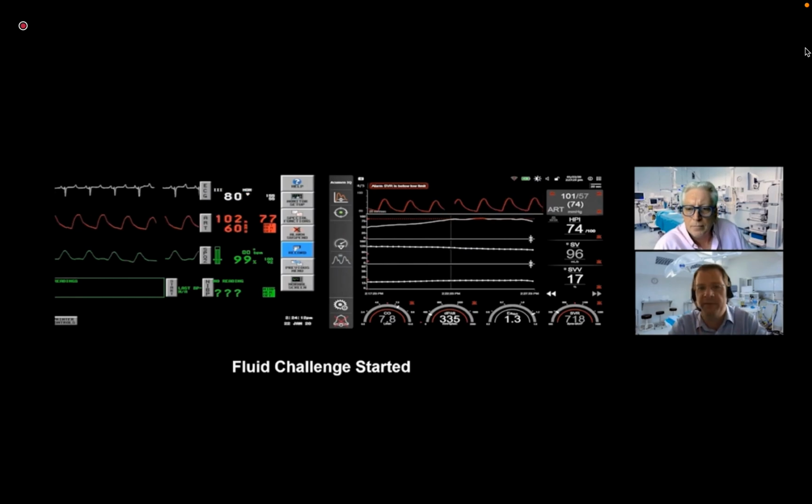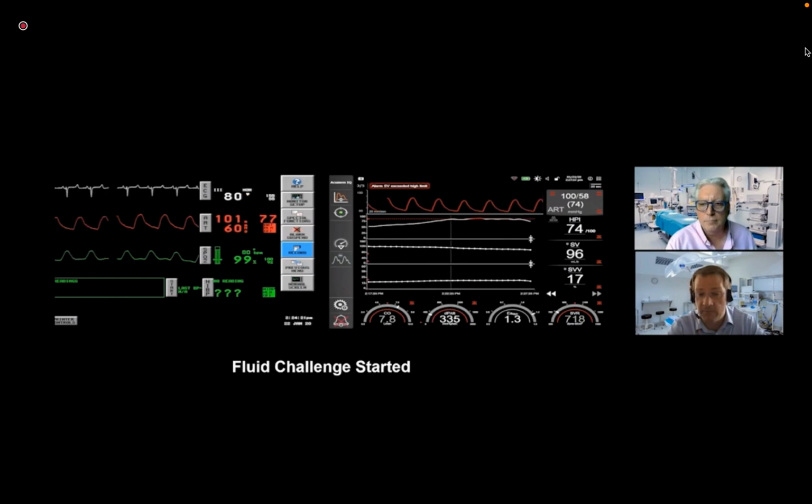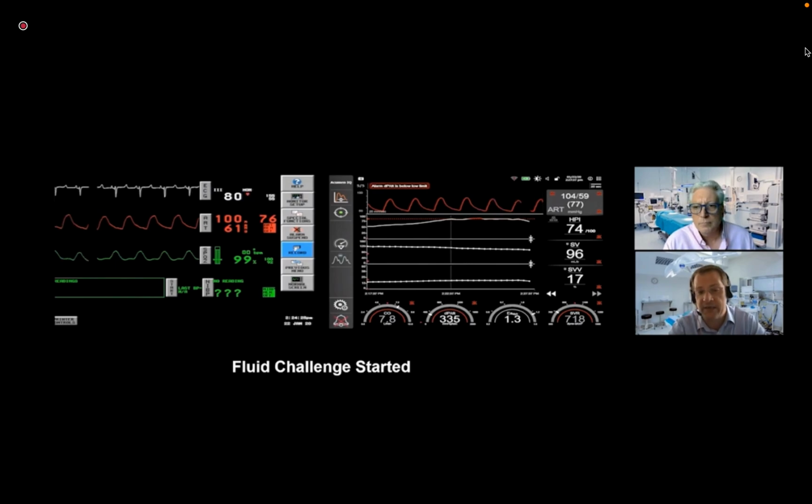So in this situation, we all know they need fluid. It's screaming high. SVV is really high. We know there's been a hemorrhage. So we know giving fluid is the right thing to do. We know giving fluid will improve our stroke volume because our stroke volume variation is raised. What Ea dyn tells us is, will that also fix the hypotension problem? So it's letting us know whether the intervention we're giving is going to fix our flow and our pressure, or just fix our flow.